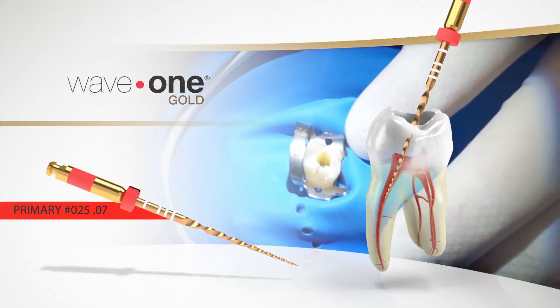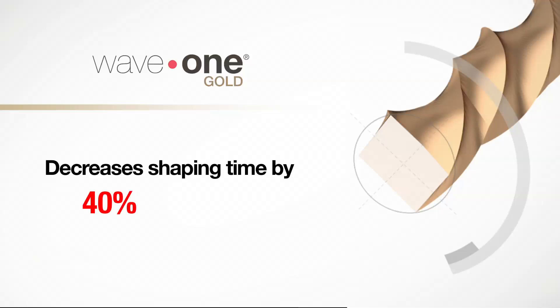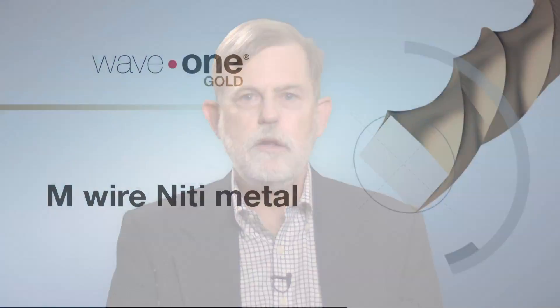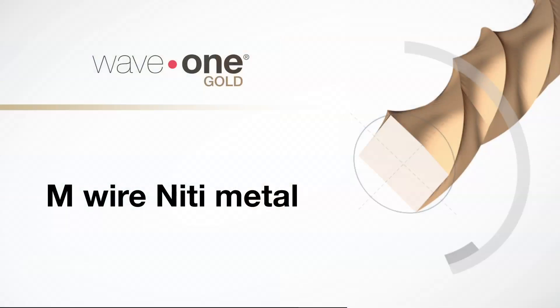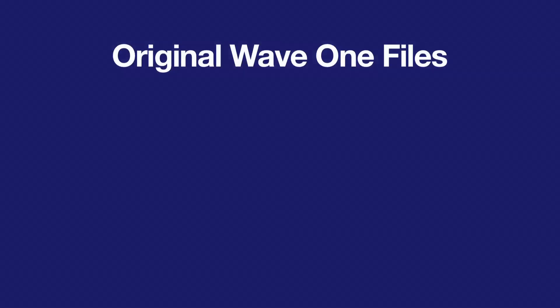This all leads to a decrease in the chance of file breakage. The modified reciprocating motor with the Wave 1 file has been shown to decrease the shaping time by about 40% when compared to a traditional rotary technique in continuous motion. The original Wave 1 file is made out of M-wire Ni-Ti metal. This provides greater resistance to cyclic fatigue, which is the leading cause of file separation. Testing shows it increased this resistance by over 130% over regular Ni-Ti rotary file instrumentation.